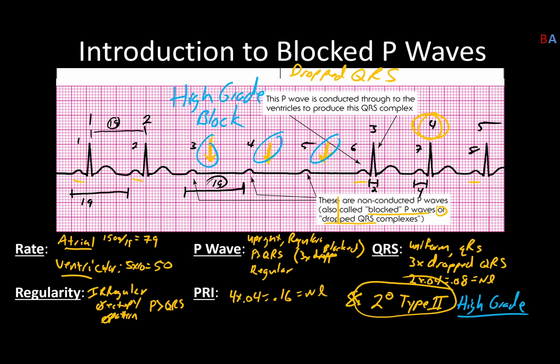And being able to say that and point that out really just shows the level of severity of what's going on. You know, it's beyond a ratio at that point, but saying that we're missing multiple heartbeats because of what's going on.